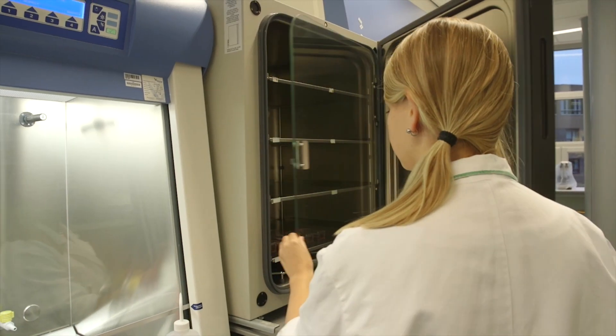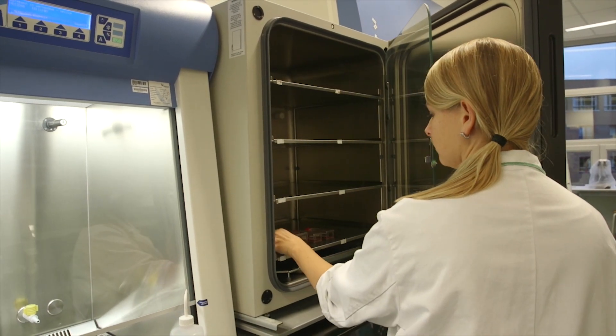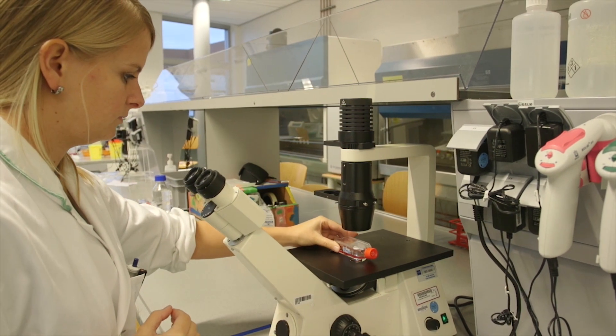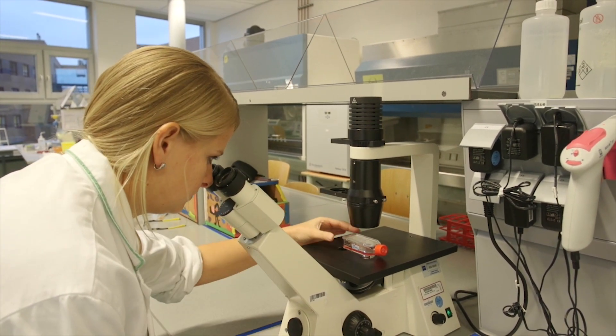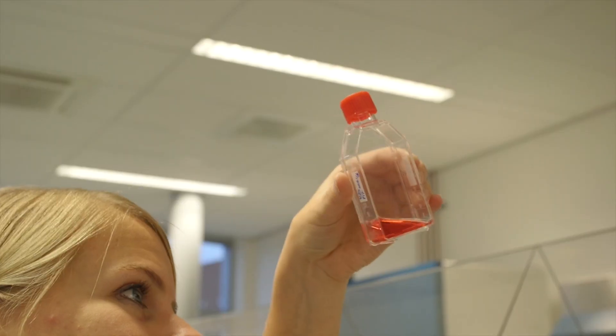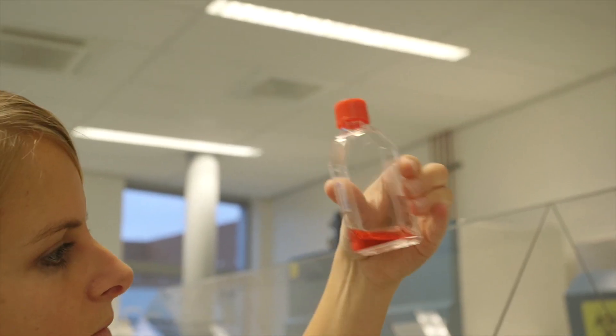Before you start, look at the cells in the culture flask using the inverted microscope. Take note of the confluency, if there are many dead cells floating around, and the morphology of the cells. Also, check the colour and cloudiness of the medium.